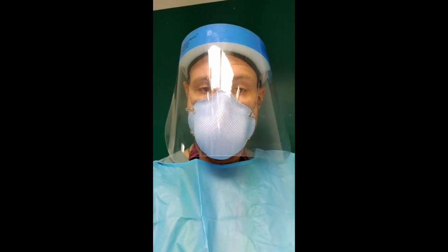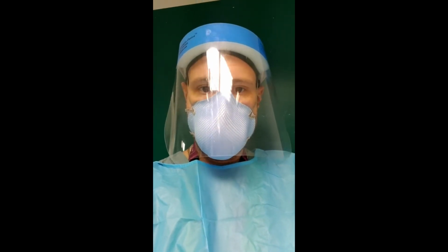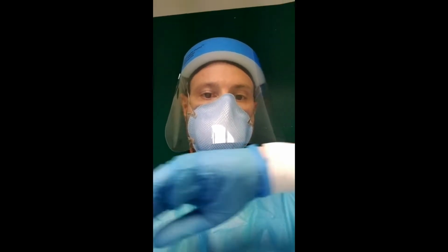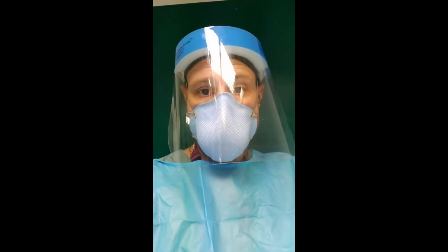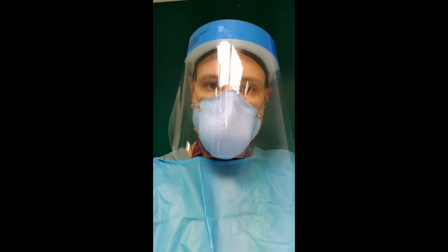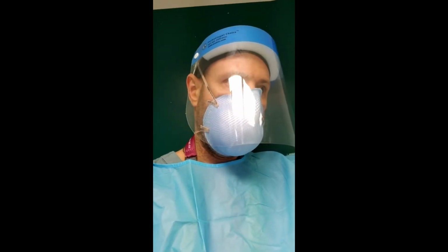And then after, don't forget, we do the diagnostic, the custom analysis, where we're looking for regional distribution, changes in compliance, changes in regional compliance. So then after, you just check all the different levels, and as long as you start seeing increases in compliance in those regions, you're more confident to increase it. You're really not guessing at all.